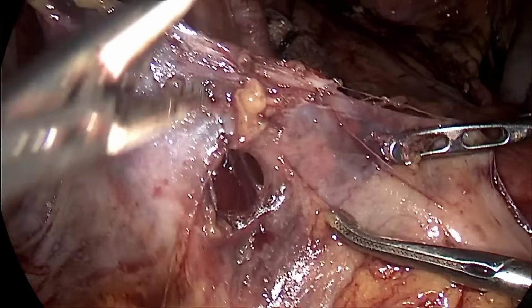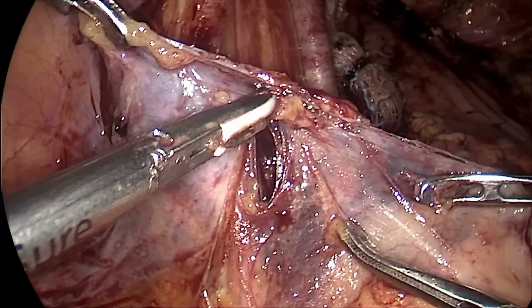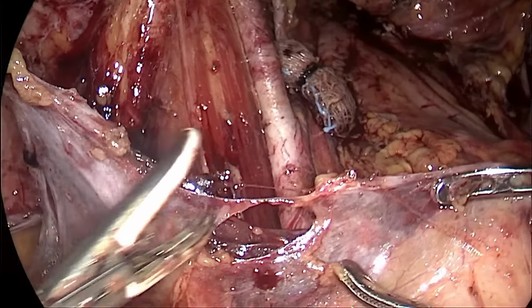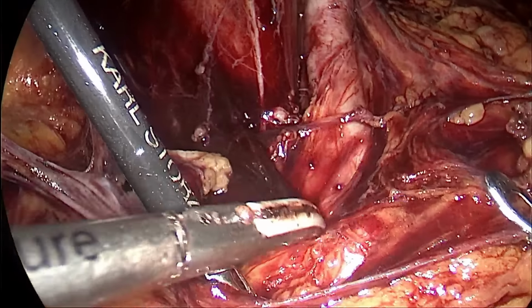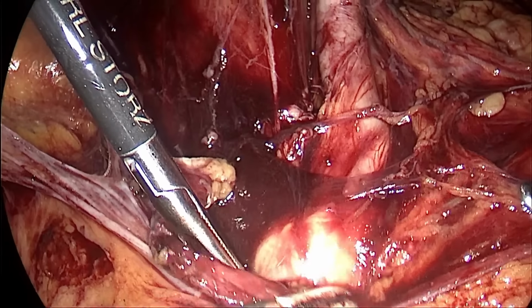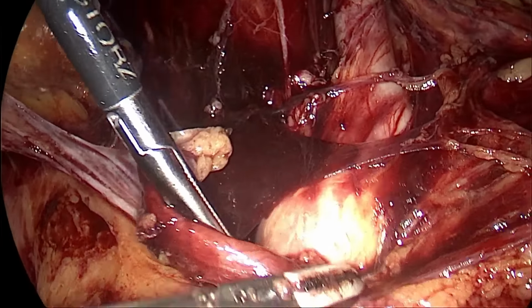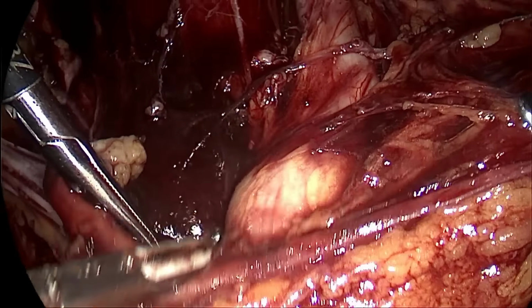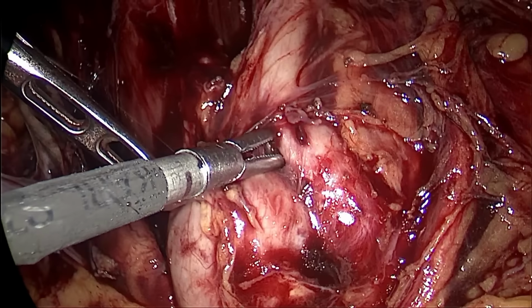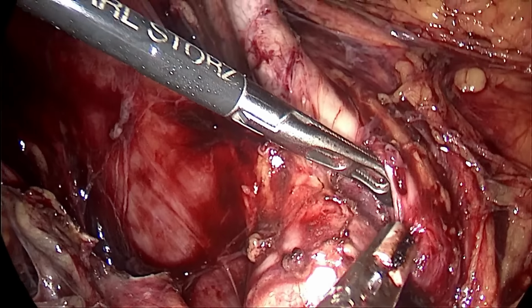So in this case, in the imaging, the patient has a very enlarged left-sided para-aortic node. So we are proceeding to that area. So here we can identify some large node is coming up. That node is also stuck with the vessel.